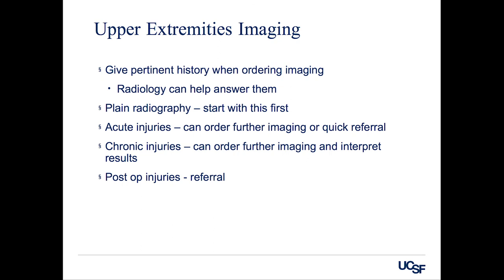Start with the plain radiograph, okay? Don't go straight to an MRI for everything. There's a lot of things that can be picked up on an x-ray first, and a lot of things that can be ruled out on an x-ray first. And then for acute injuries, you want to try to image those a little bit quicker, especially when the examination is very hard because the patient has a lot of pain.